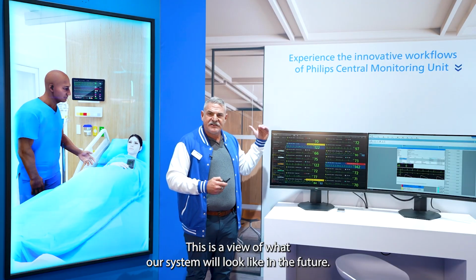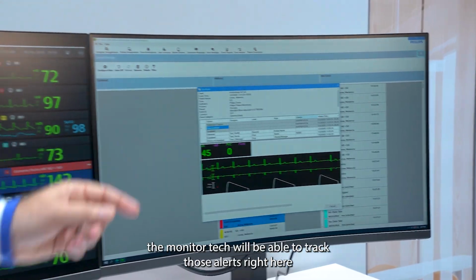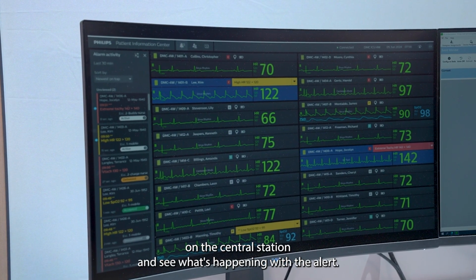This is a view of what our system will look like in the future. So instead of having a separate screen, the monitor tech will be able to track those alerts right here on the central station and see what's happening with the alert.